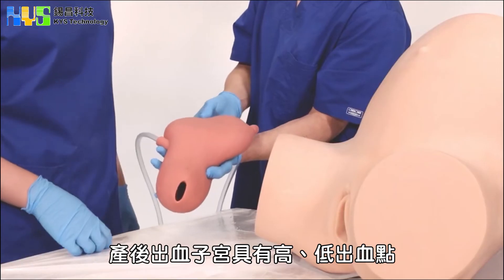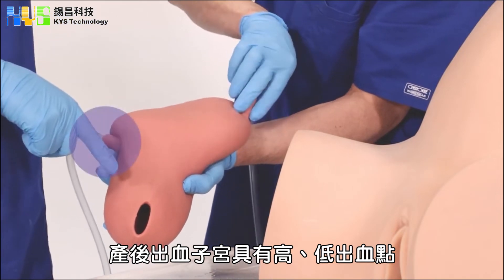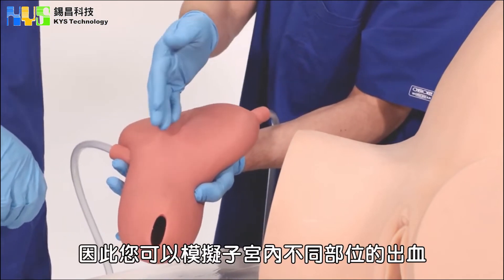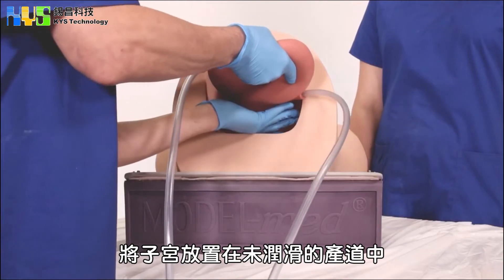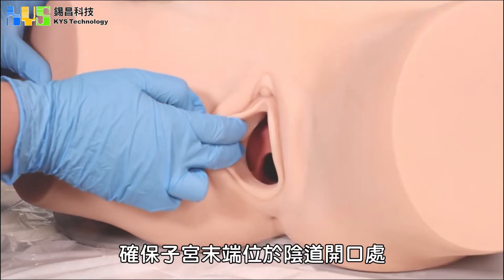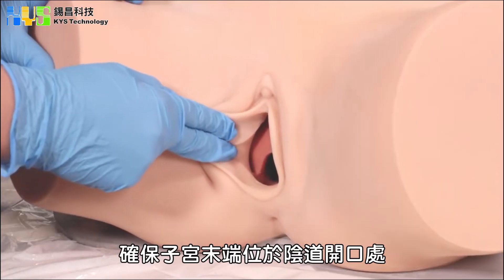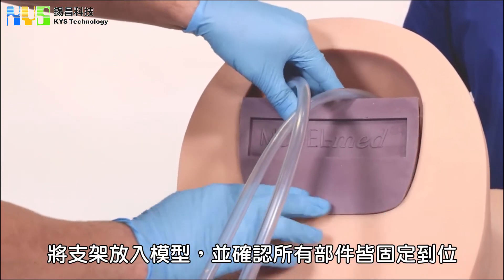Take the postpartum hemorrhage uterus. There is a high bleed point and a low bleed point, so you can simulate bleeding from different points inside the uterus. Place the uterus in the birth canal unlubricated. Make sure that the end of the uterus is at the opening of the vagina. Take the cradle and insert it to hold everything in position.